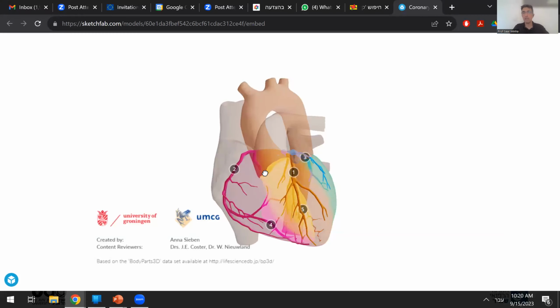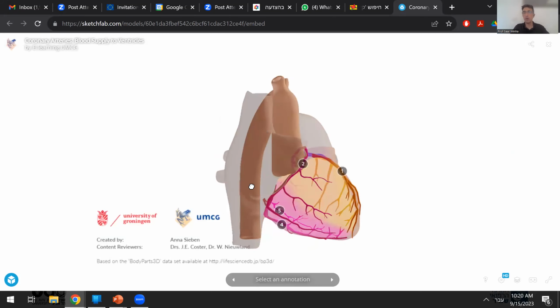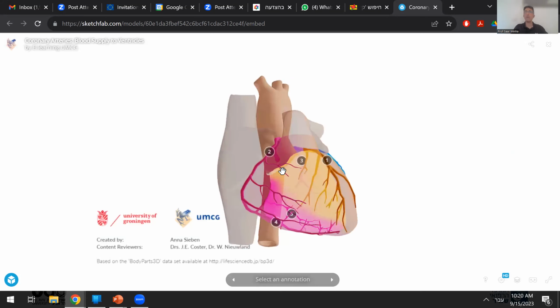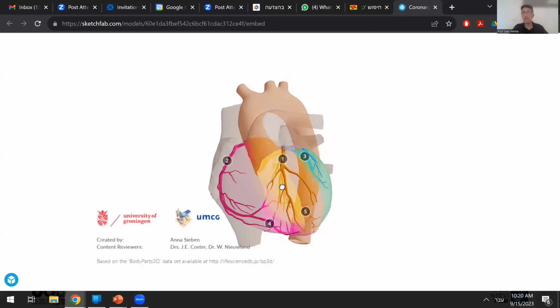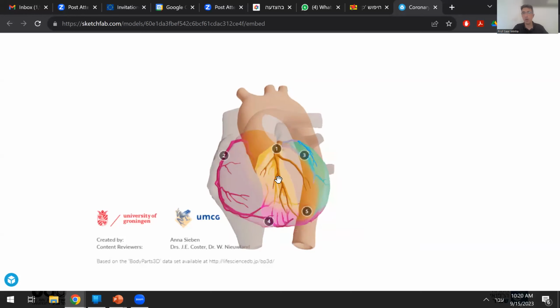So let's say that the patient is lying down. If I do want to see this projection or this projection, I won't be able to ask the patient to just turn to the left or turn to the right. This is a patient suffering from a heart attack. I want him to lie still. So I need to find a technical solution, which I will demonstrate in seconds, that will allow me to demonstrate this three-dimensional organ from different angles. And I hope I'm making sense by that.